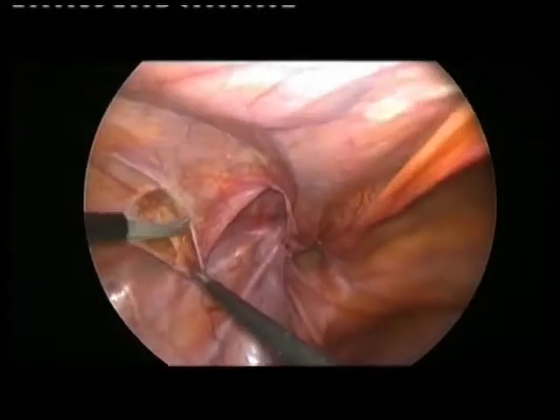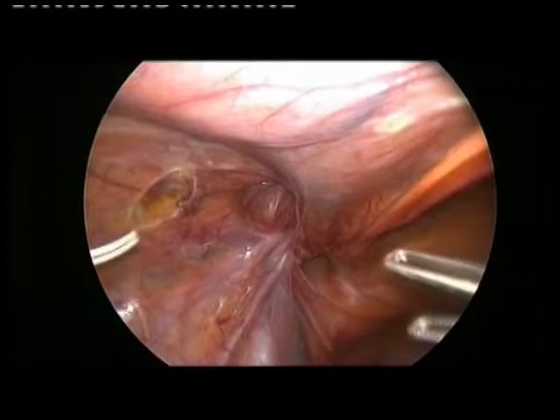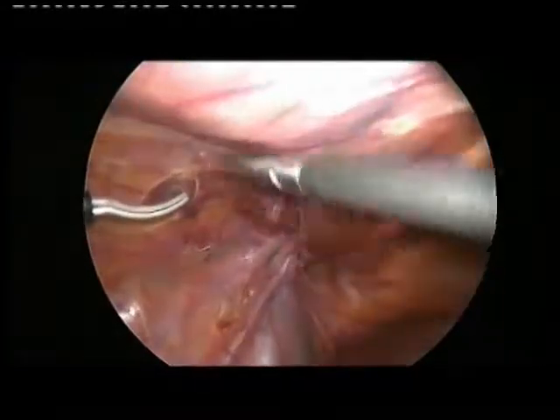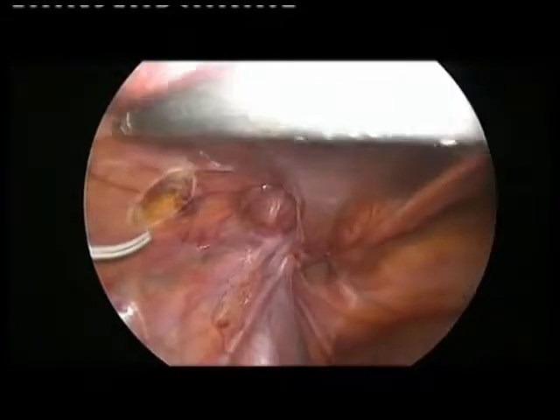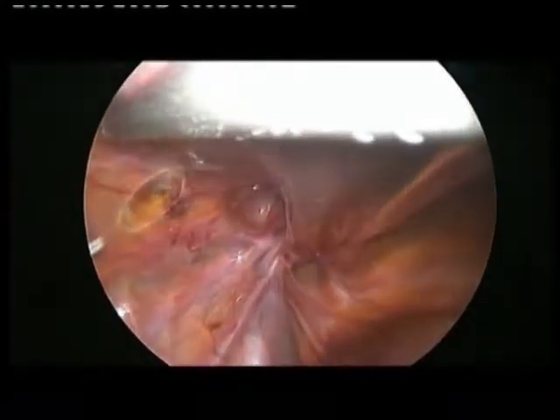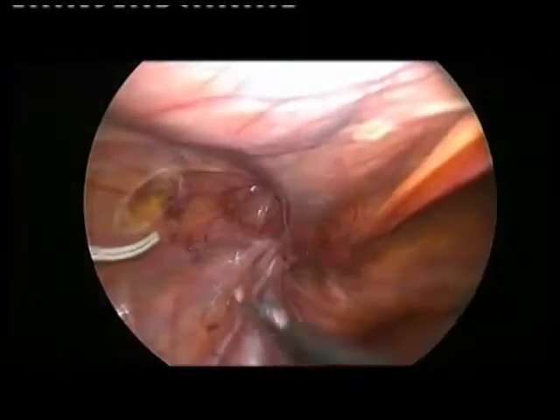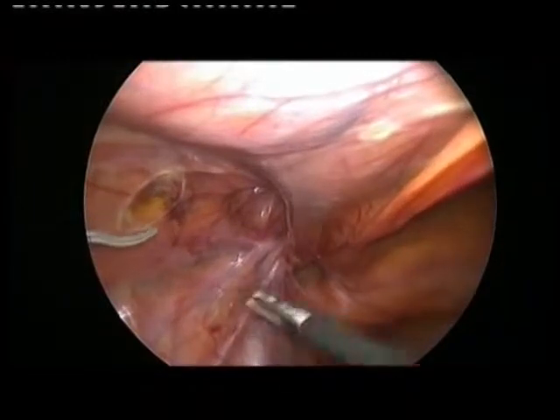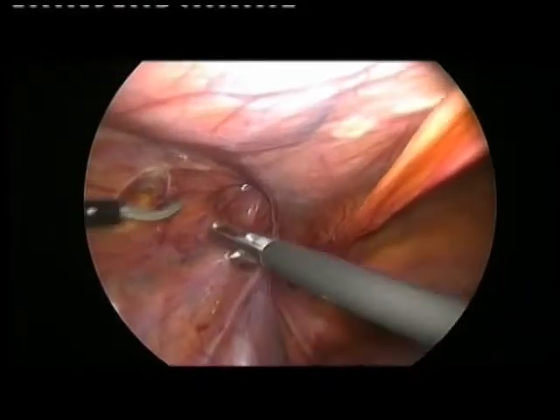Do you see? I'm using the laparoscopic camera, the HD of Storz. You have seen this perfectly. Also, the outside picture in air is quite good. You see here? This is the ureter. I already put 2 stitches, which are proximal.